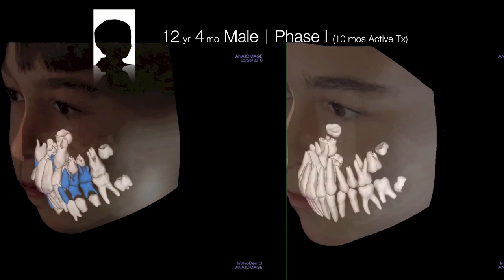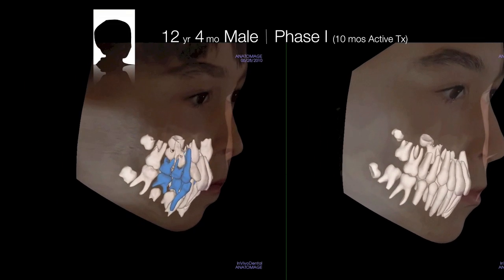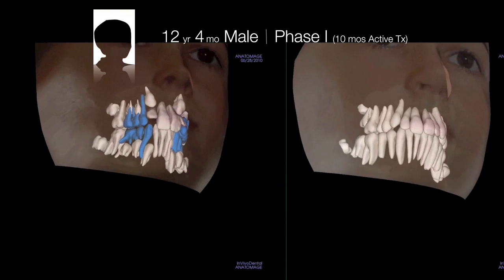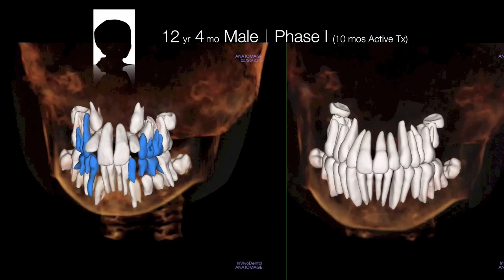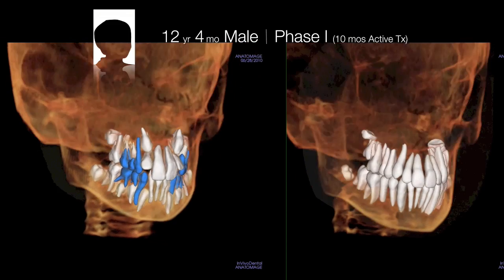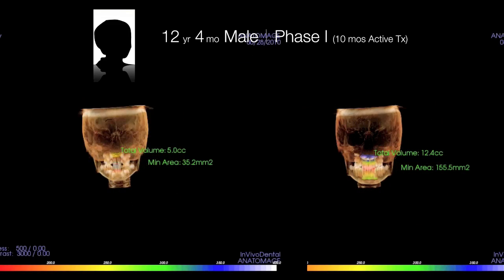And here you can see this patient treated, and it's quite simple when you know what's going on. It's quite simple to use some very careful eruptive guidance and some expansion to resolve these impactions before they actually occur. And here you can see on the right-hand side of the screen, those two permanent maxillary canines actually erupted into a very nice position. And this case is actually quite simple because we knew exactly what was happening from the beginning.